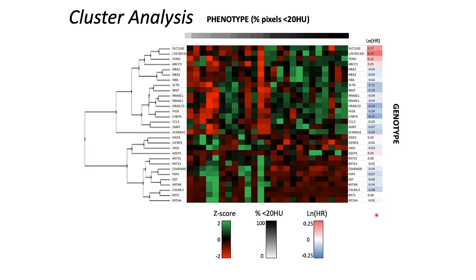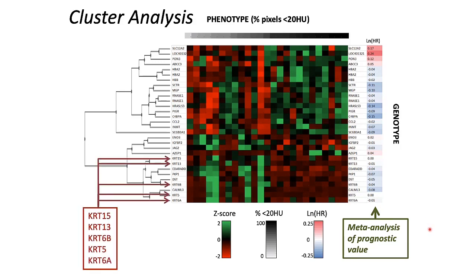But then, when looking at the known studies on whether these genes were prognostic, it was found that none of these genes were prognostic. So here we have an imaging marker that is prognostic, whereas gene correlates are not. But we did find that a number of these genes were related to keratin, and keratin, that we know, is of high density on CT.